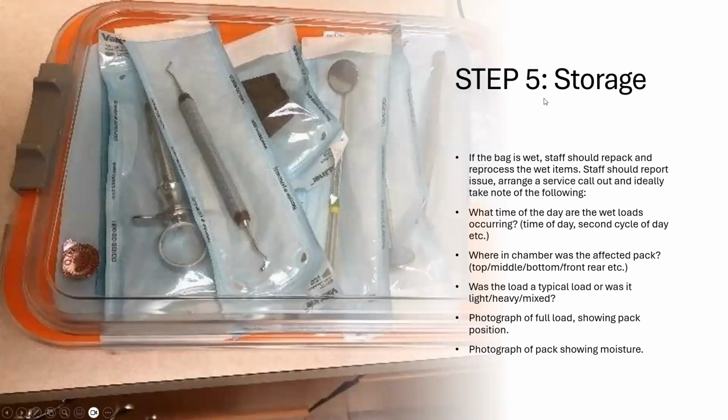Now, storage, step 5. If the bag is wet, staff should repack and reprocess the wet items. Staff should report the issue, arrange a service call out, and ideally take note of the following: what time of the day the wet loads are occurring, such as first, second or third cycle of the day; where in the chamber the affected bag was, top, middle, bottom, front, back, etc.; and whether the load was typical, light, heavy, or mixed.